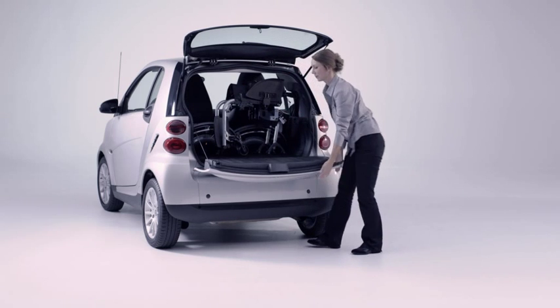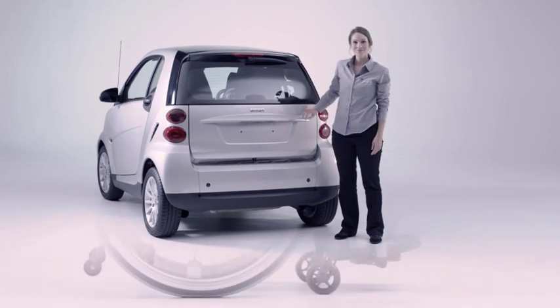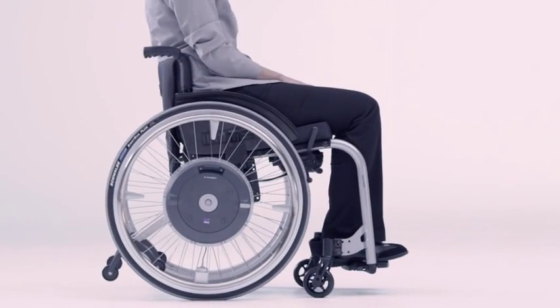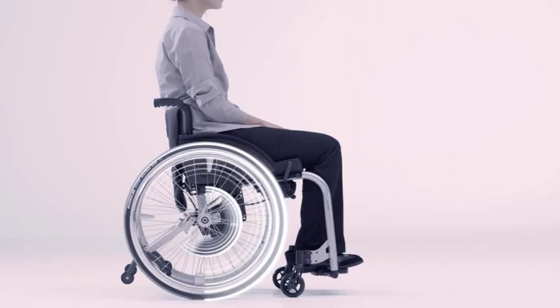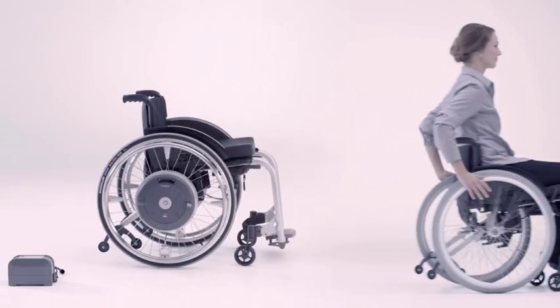E-Motion is ready and waiting to go in a matter of seconds. The highlight: the wheelchair can still be used as a normal manual wheelchair. Just couple up the conventional wheels and you have two wheelchairs in one.